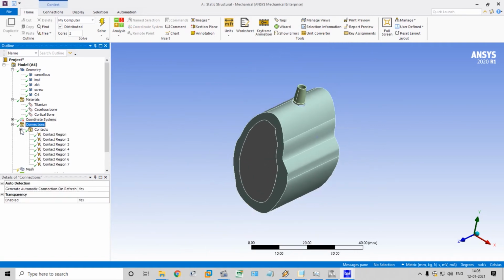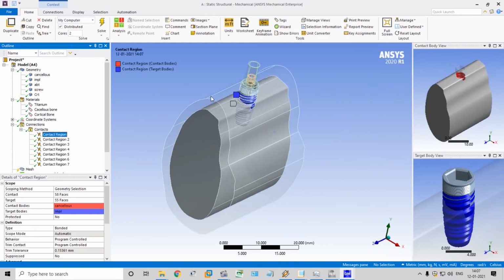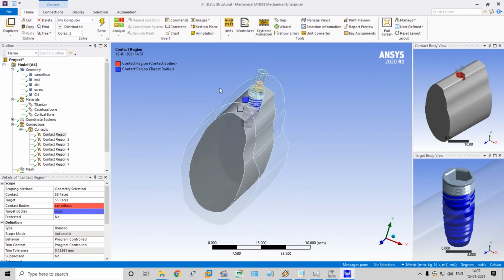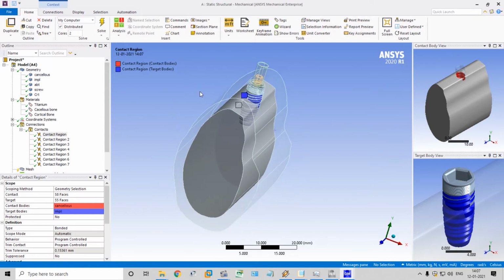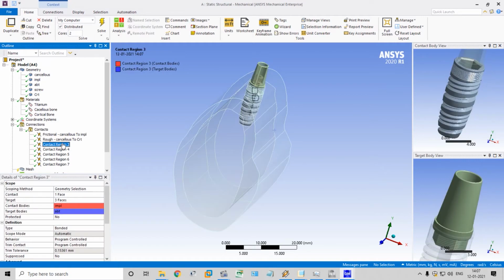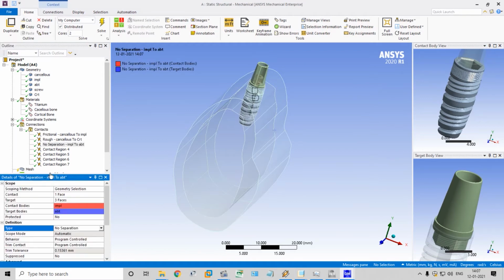Connections: what are all the contacts between the bodies? Contact between the five bodies. Okay, now the cancellous and implant will be frictional because the thread is there. Contact between the cancellous and cortical bone will be bonded or rough, either your choice. Then implant and the abutment will be no separation, that's all.